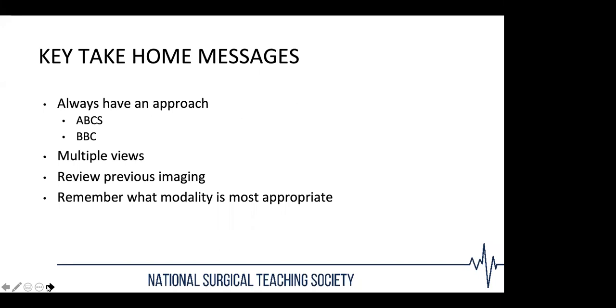I'm also going to stress the importance of having multiple views. You don't fully gain an appreciation for what a lesion or a fracture will look like unless you've seen it in multiple views. Again, it's really important to review previous imaging, even if it's not the same modality. So for example, X-ray to X-ray. If it's X-ray, but there's a previous CT, it's really helpful to read the report and try and look at the images to see how things have changed since the previous scans the patient has had.